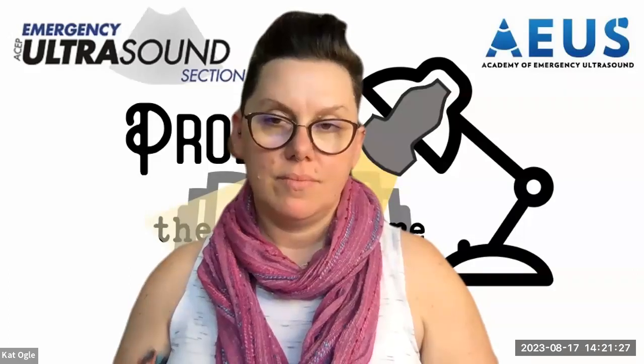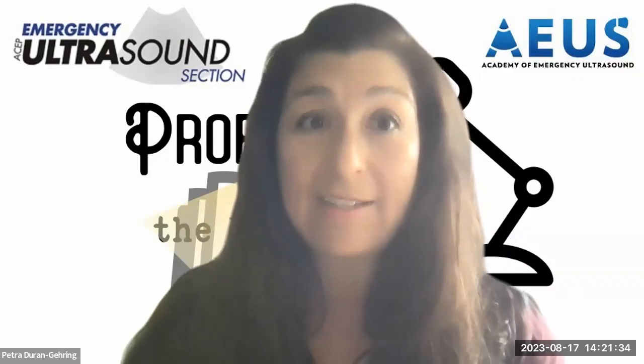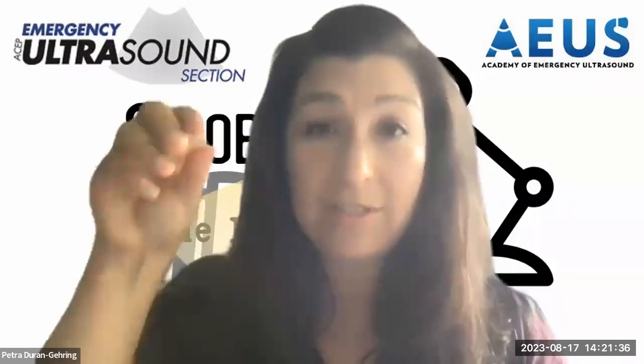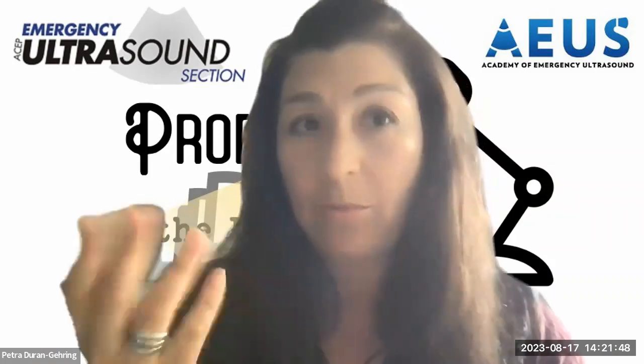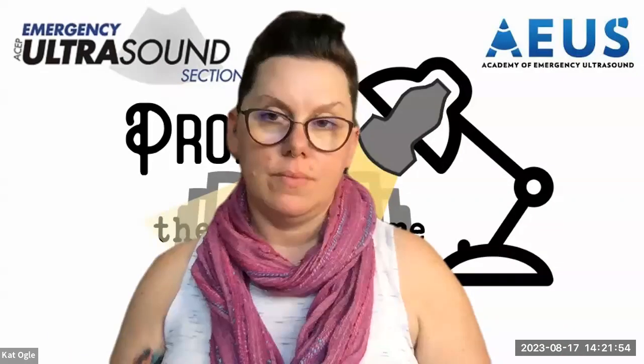It's interesting. Yeah, we always do the discussion. I always tell the residents, if the object is moving, you need to be still. You often see, especially with learners, that they are trying to get a clip so quickly. Our residents are taught to slide down. Well, I'm like, but you have to pause at each interspace. If you're sliding down the chest, is that moving? I can't tell what's happening. So that's the rule of thumb we always say: if the object's moving, you hold still. If the object is still, then you can fan through it and move.